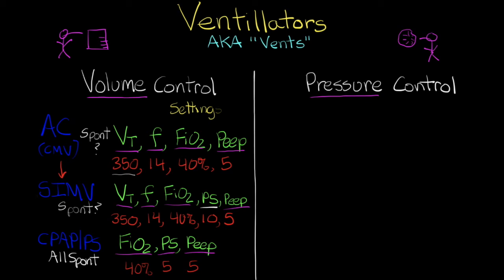And then we know that the patient is going to have to put in actually a little bit more effort into taking each breath than if we were to take that tube out. So if they're doing good on a pressure support of 5, and typically we won't leave the patients with this level of pressure support for more than, usually it ranges from 30 minutes to not much more than 2 hours. If they do good with just a pressure support of 5, when we take that tube out, it's going to actually be a little bit easier for the patient to breathe.